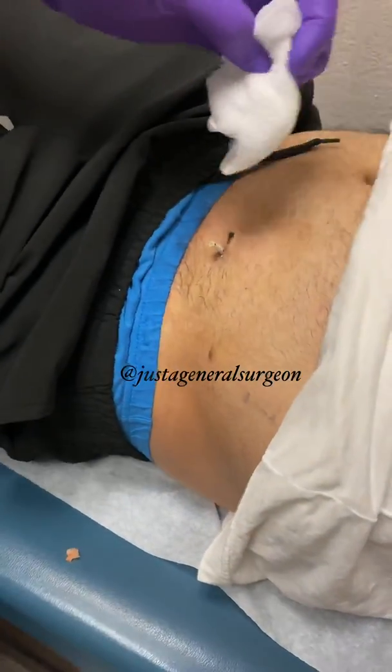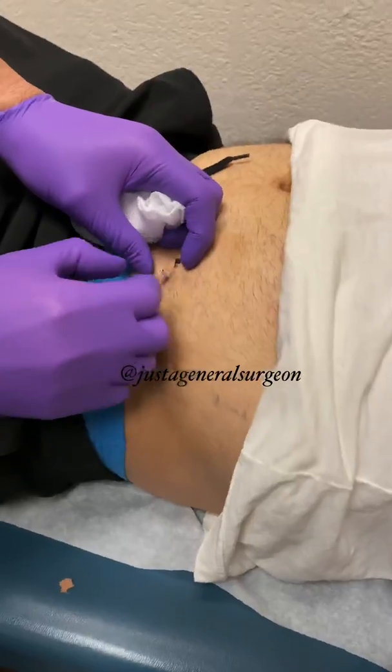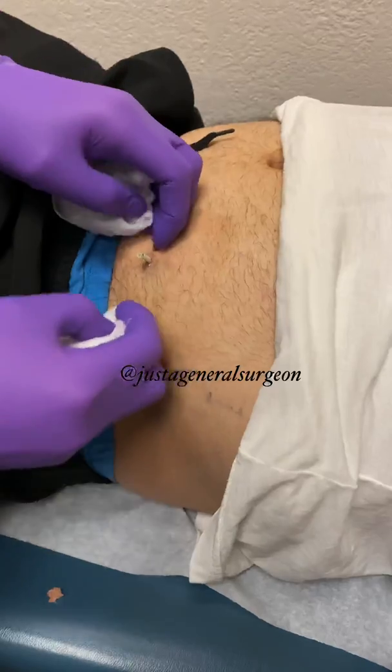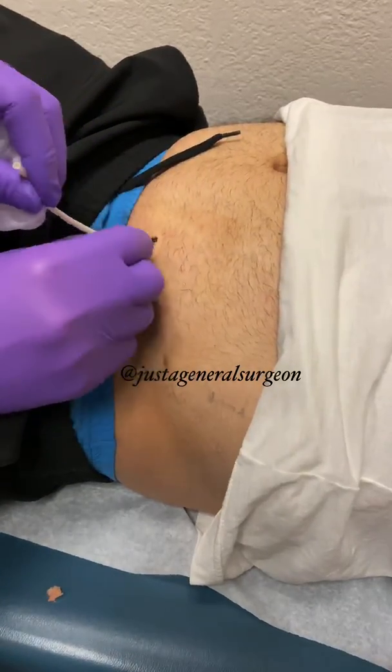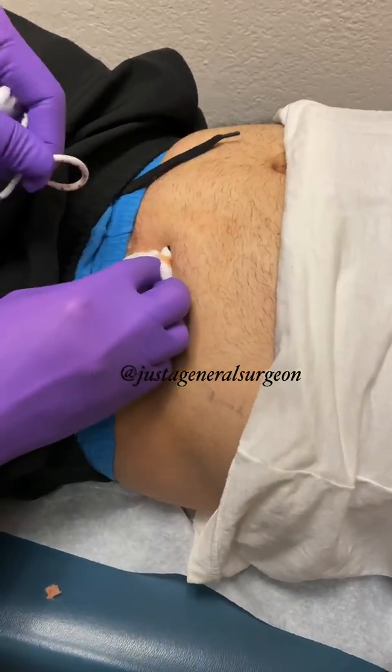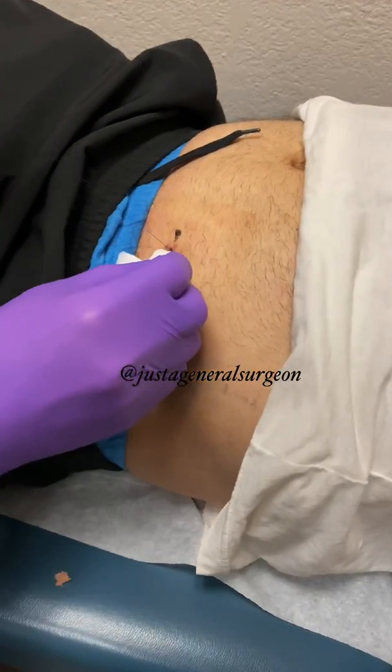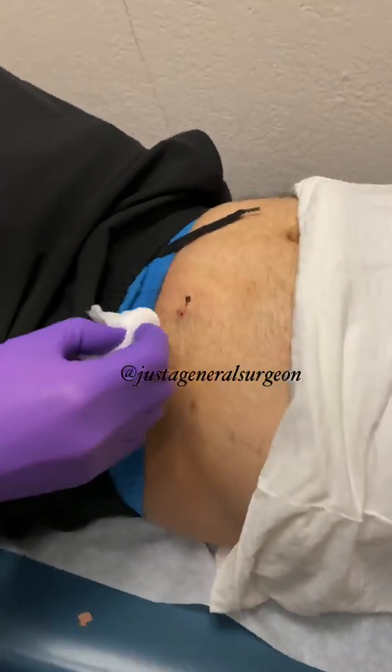Then we remove the actual drain by applying a little firm, steady pressure. You're going to feel a little pinch as we remove it. And here's the little string that I cut that was holding the shape of the pigtail — all completely removed.